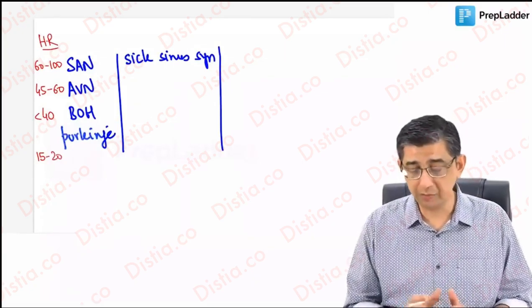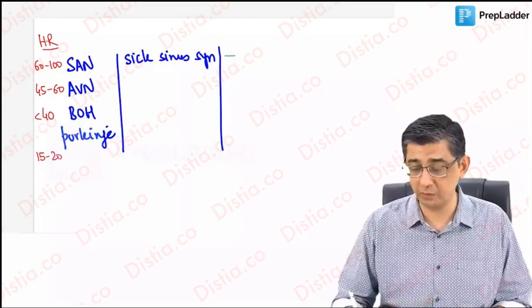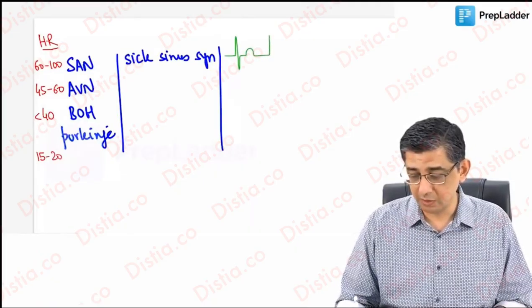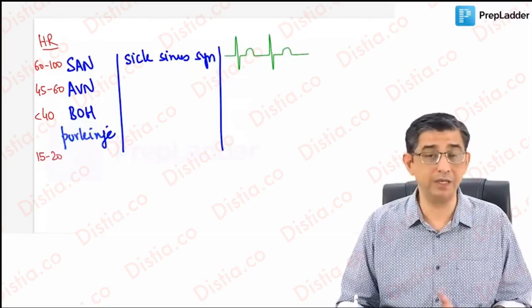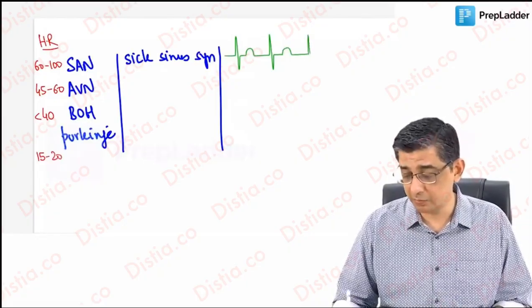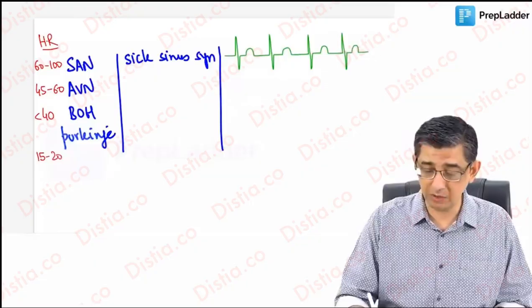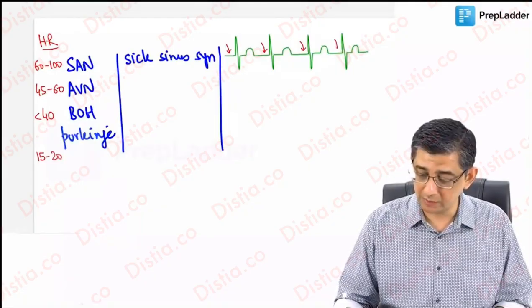Now, in a person who's suffering from sick sinus syndrome, the ECG will evolve like this. There will be no P waves because the SA node is not functioning at the moment. So you will get a QRS complex that might be normal, slightly delayed or broad. Then there would be a T wave. I am describing an ECG in which there are absent P waves. There is a tachyarrhythmia in which there are absent P waves, that is atrial fibrillation. But at the moment, we're talking about a bradyarrhythmia in which there are absent P waves, which is sick sinus syndrome. T waves might be decipherable, but before every QRS complex, what should always come is a P wave, which is missing in this case. I'll just put a pointer here to highlight that I expected a P wave to be present at any of these areas, but it is missing.